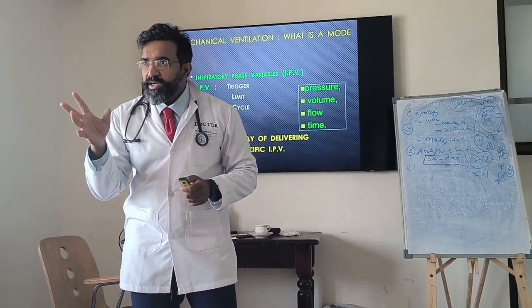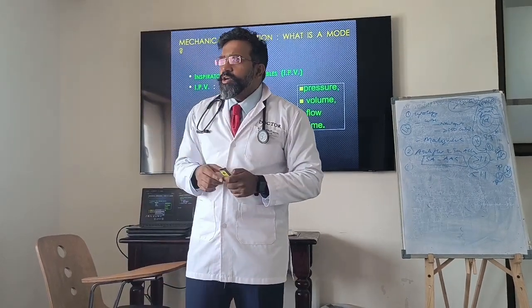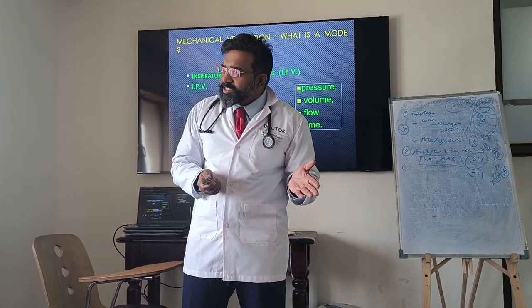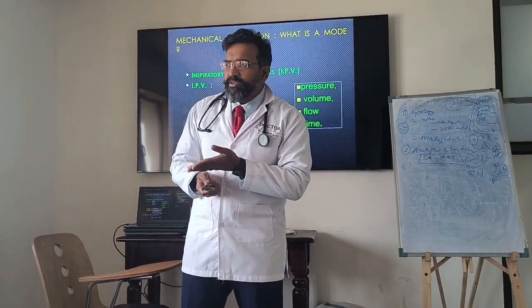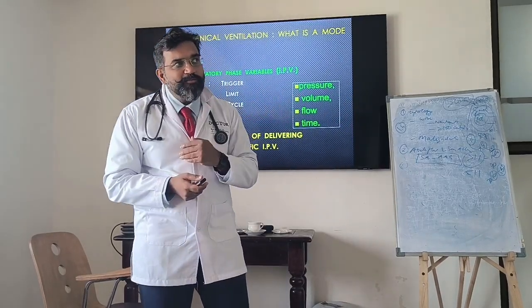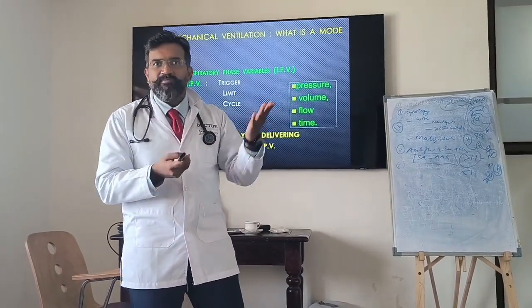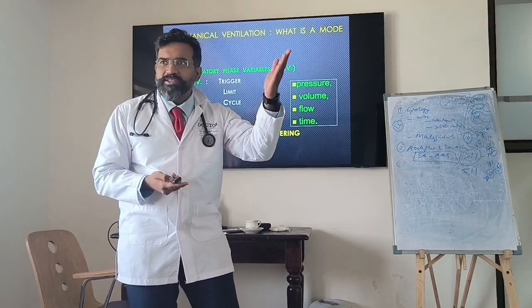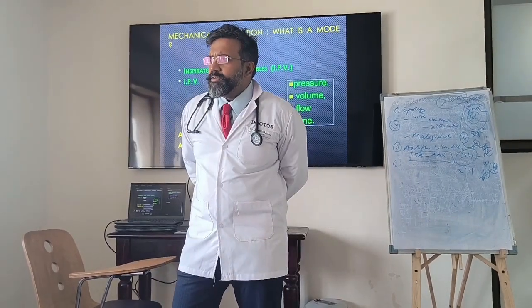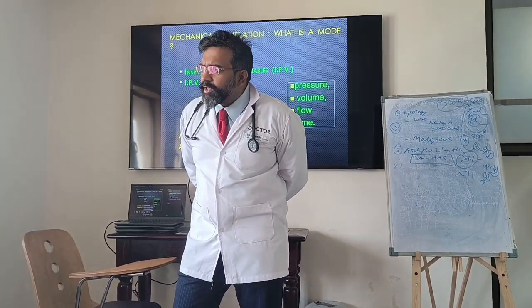Are you understanding? Have you got the point? Because tomorrow when you are going for an exam, you will not understand what terminology is written unless you understand the breath type. Tomorrow when you are going to a second ICU, you will not realize what kind of mode is happening unless you know what the waveform looks like. If someone tells you the patient is on BiPAP, you should know that it is pressure control.